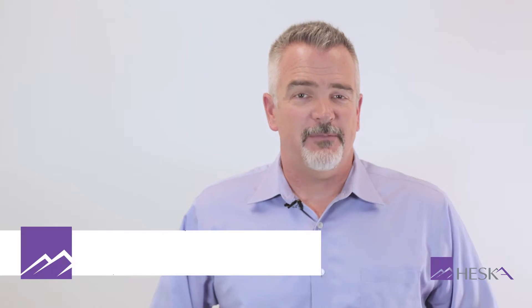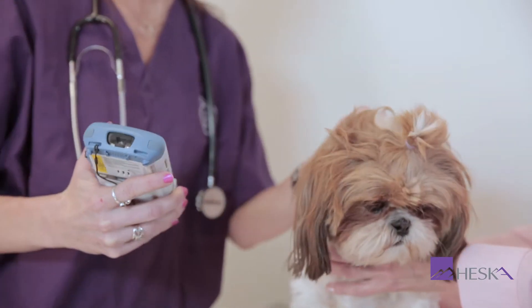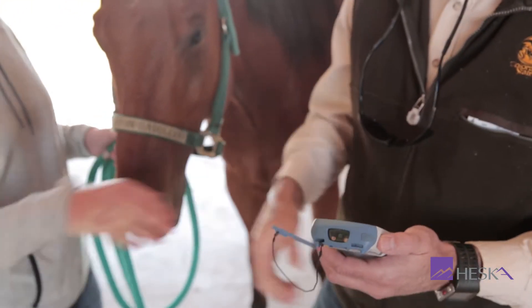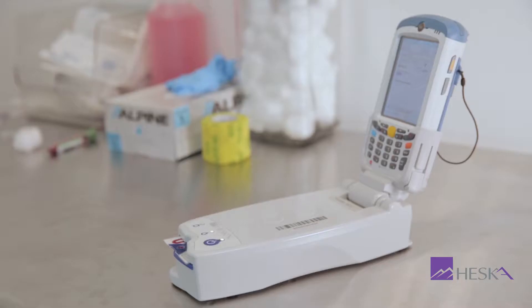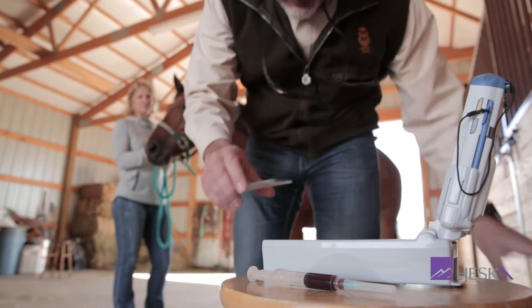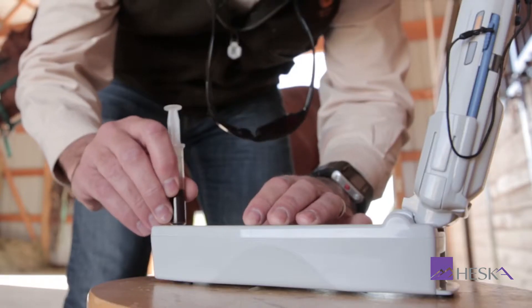The EPOC handheld analyzer completes your in-house diagnostics. Take a rapid first look at patients, diagnose challenging disorders, add ionized calcium to your electrolytes, get mobile analytics in the field, or have a backup for complicated benchtop blood gas analyzers. With as little as 100 microliters or two drops of blood, you can get 11 measured and six calculated test results patient side in just 35 seconds.